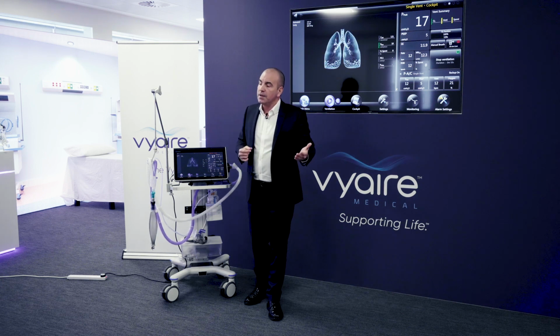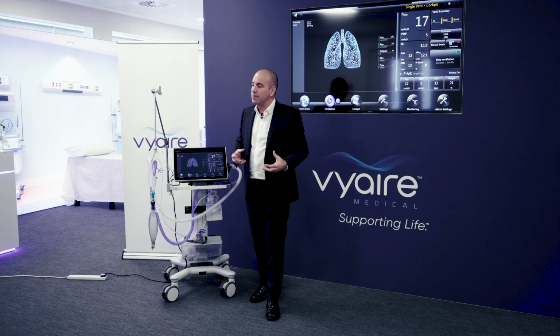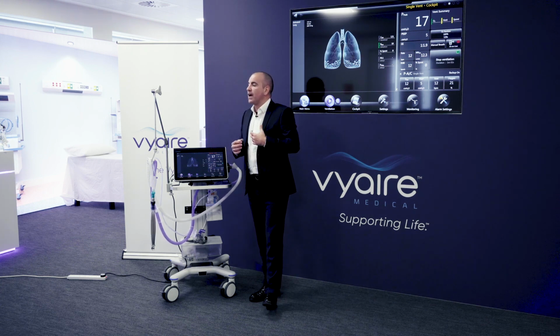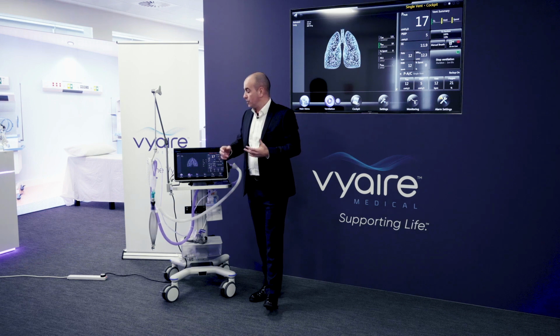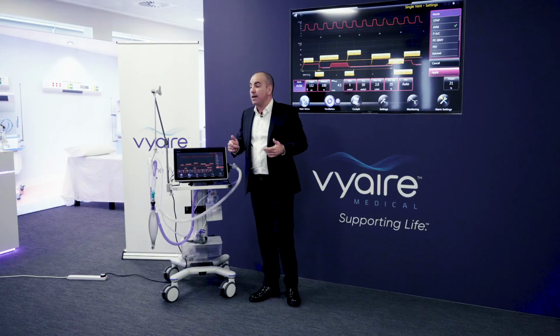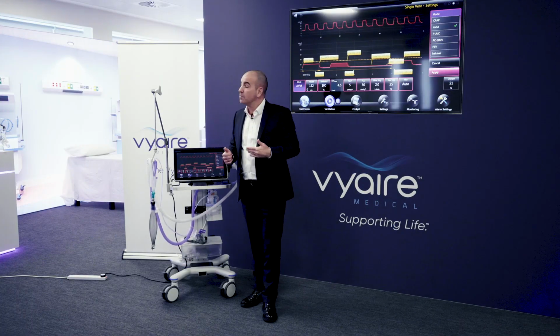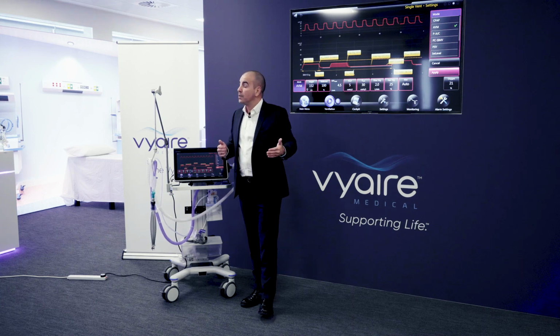Going back to the earlier comments before about clinicians having less resources, less time, being able to provide them a workflow solution. I'm going to change the mode here. So AVM, adaptive ventilation mode. It's a mode that the doctors can use from the moment the patient comes into the ICU doors to the moment the patient's potentially ready for the breathing tube to come out.